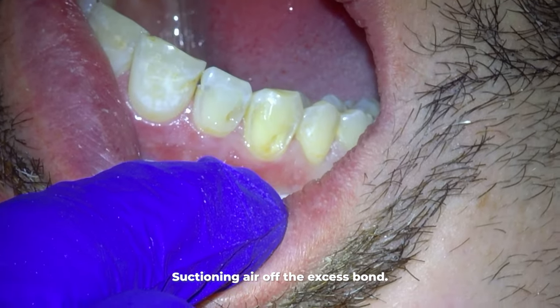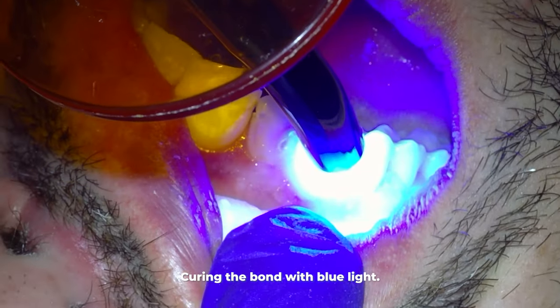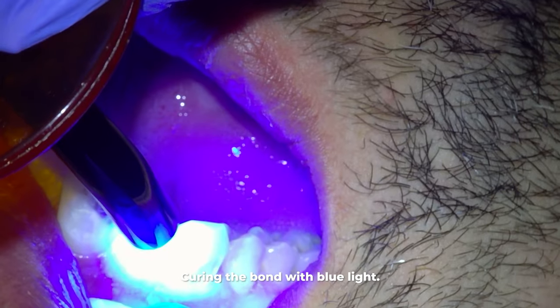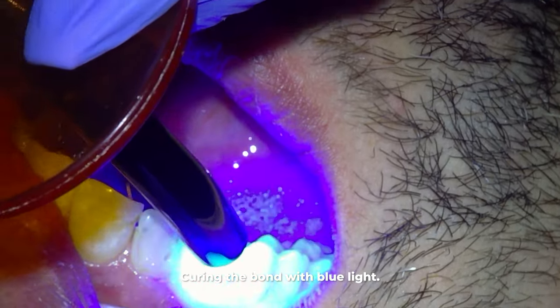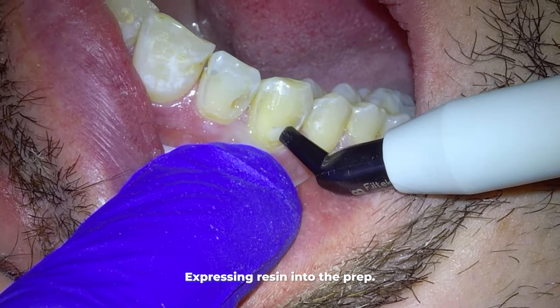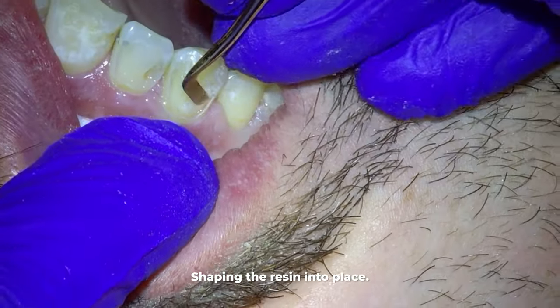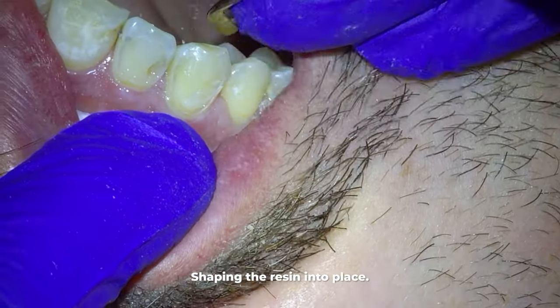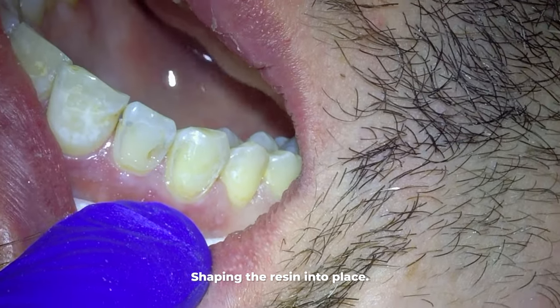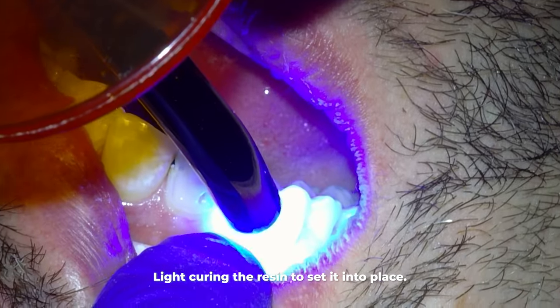We then take this little gun that has the resin filling material in it and express it into the prep, using instruments to shape it into place. While doing this I'm also checking to make sure the filling color matches the rest of the tooth. If it didn't, I would quickly remove all the resin, get a different shade, and place that one into the prep. When doing any resin filling it's essential to fill the tooth in layers — first I press the filling so it adapts tightly to the upper part of the prep, then I light cure it and set it into place.